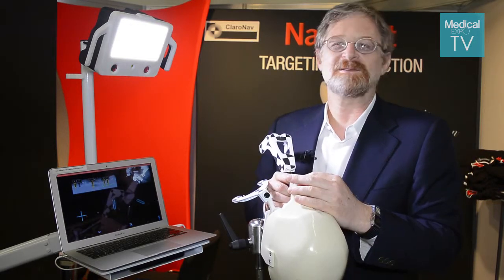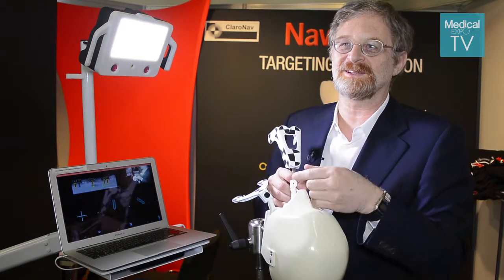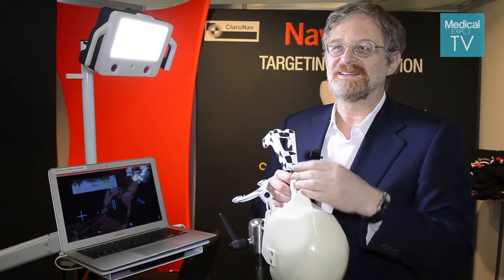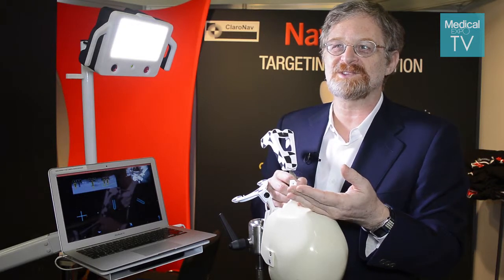Another big advantage is that because you don't have to see the bone directly when you drill, we can do the surgery without cutting the gums and lifting them — what's called raising a flap.